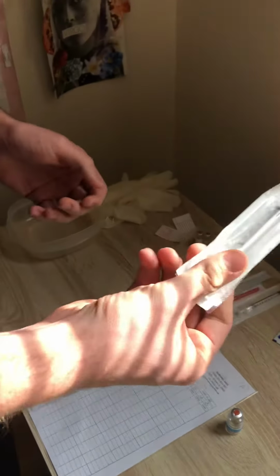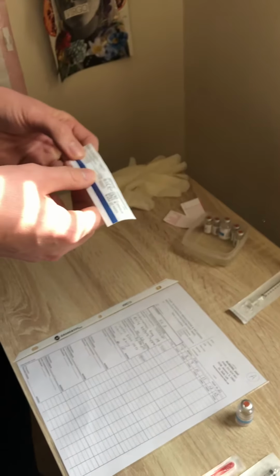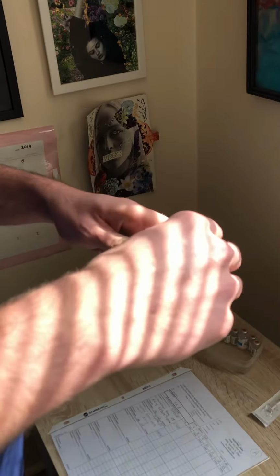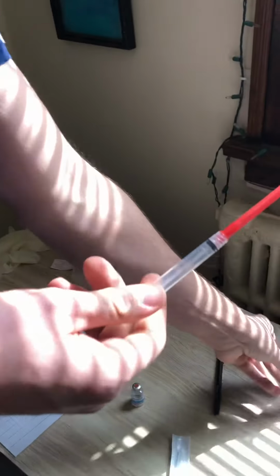And then we're going to gather up the rest of our supplies. So we have our 3 ml syringe. We have our blunt fill needle, as well as I'm going to be using a 23 gauge 1-inch needle. That is an appropriate needle size for an intramuscular injection. Okay, so now I'm just going to do hand hygiene again, and we'll get started. So open up this. We'll just say that's our garbage. We get our blunt fill. Wing goes back, maintain sterility. That'll go in the garbage also.